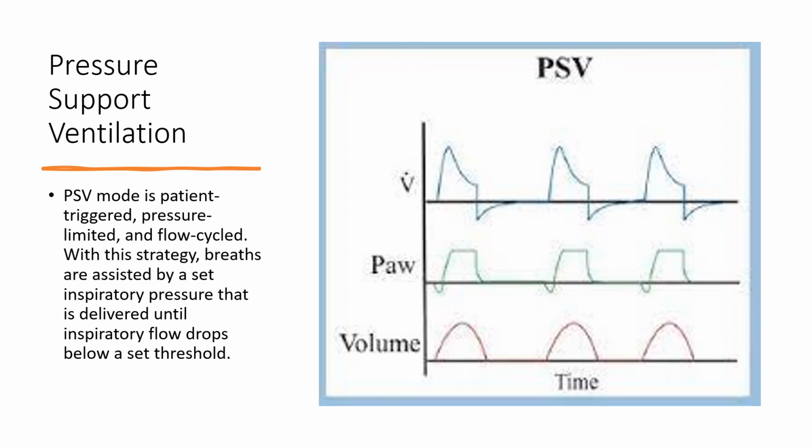The more pressure support you offer the patient, the higher the level, the bigger the tidal volume. So what you could do is wean the patient on pressure support ventilation by starting, say, with a pressure support of 12, and as they're breathing spontaneously and getting normal tidal volumes of, say, 5 to 7 cc's per kilogram, then you could wean down that pressure support level from 12 to 10, from 10 to 8, and then you could just extubate them from that point.